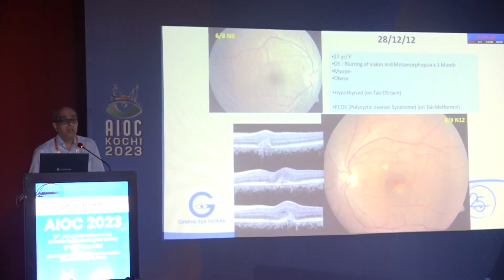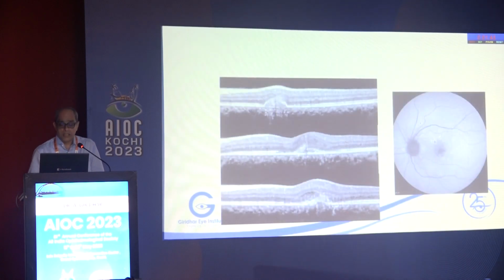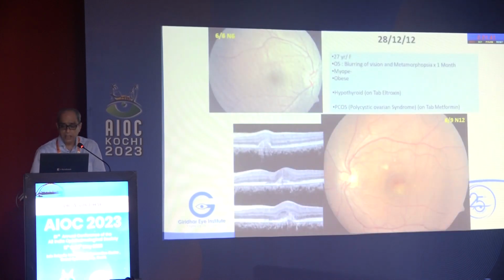It is very useful in inflammatory macular diseases. Now, if you see this patient, you can see small multiple yellowish lesions, isn't it? And if you see very carefully, you can also see a little bit of fluid and also something red in color. Now, if you do the OCT, you see how diagnosis improves nowadays. So, you see the OCT. What are you seeing in the OCT?